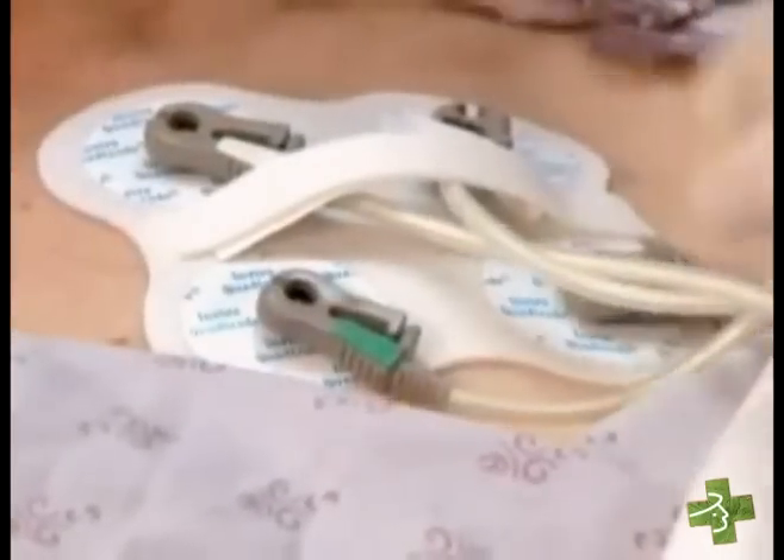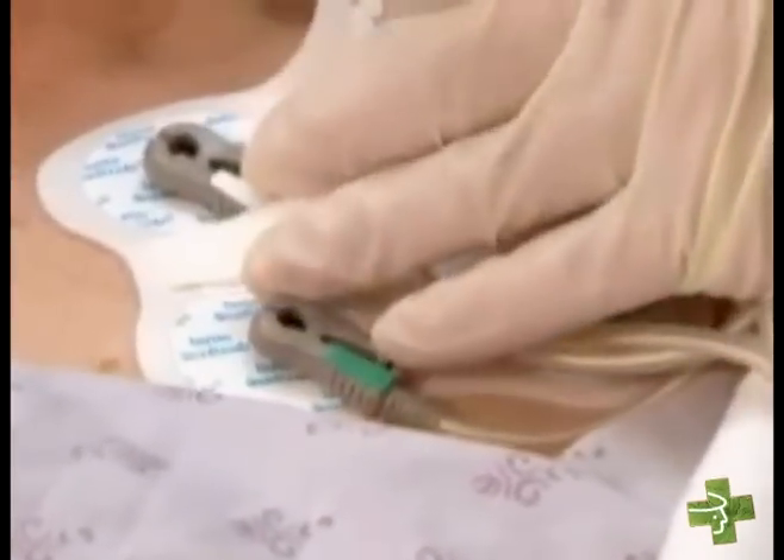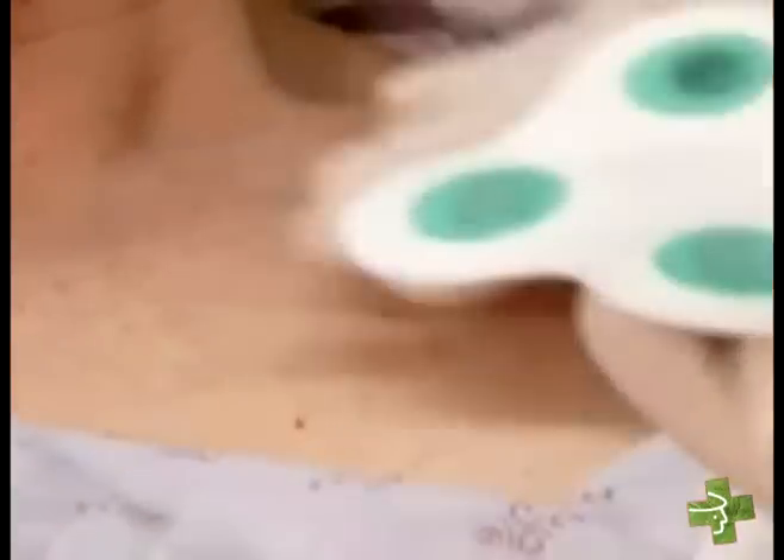After completing the MRI study, examine the patient for possible burns or reddening of the skin under the electrodes. This is especially important for patients who can't express themselves or those who have impaired sensation. If your patient has a burn, administer appropriate treatment.